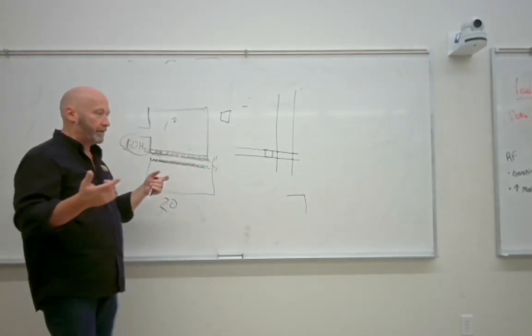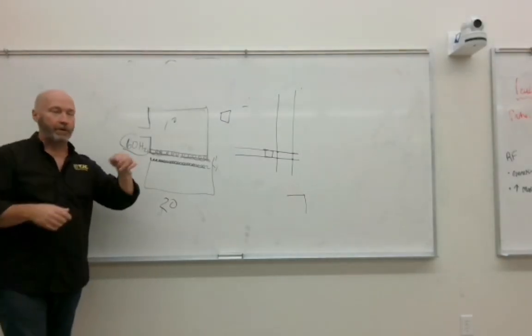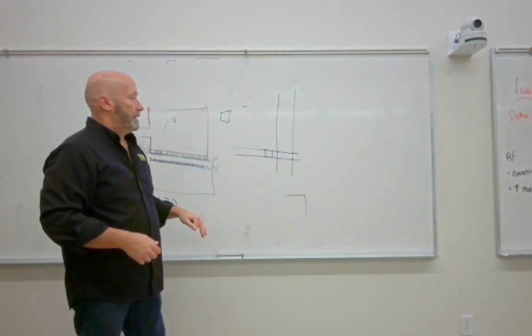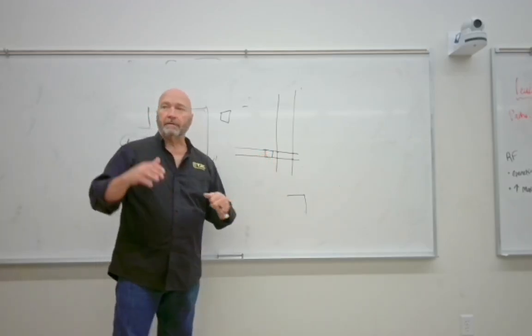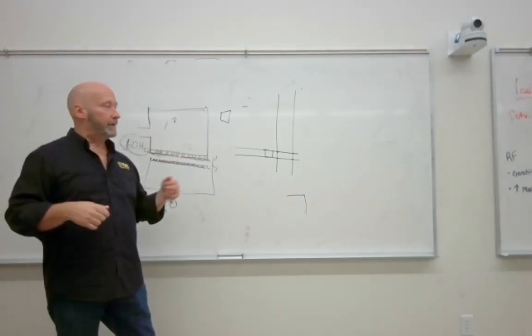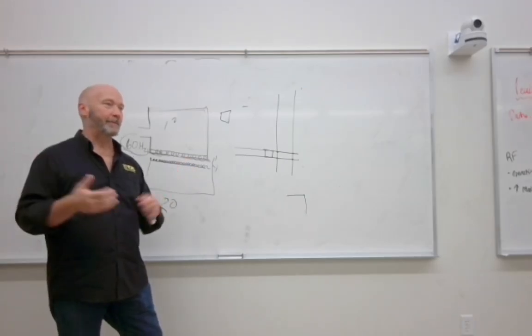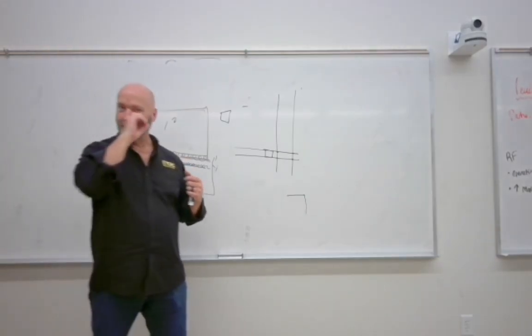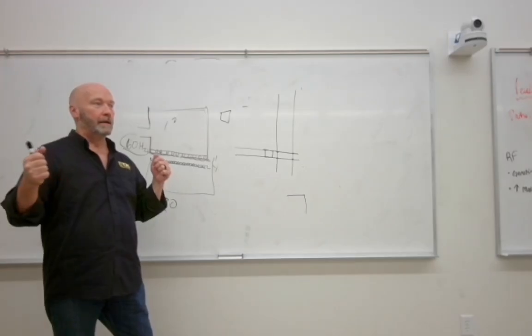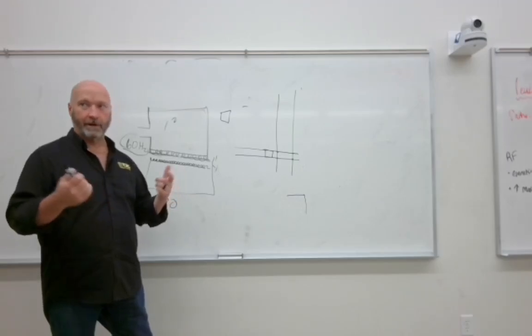It's alternating current through a coil of wire to create a magnetic field to draw those brakes down and away from those rails. Same thing in the control tower itself. You squeeze a handle, you push the buttons, you'll hear that clack and you can move it. But if you don't push the button, don't do this, because we don't have the budget to fix it if you go in and strip the brakes off this thing. But you can give it a little bump and you can feel how strong the brakes are on these things.